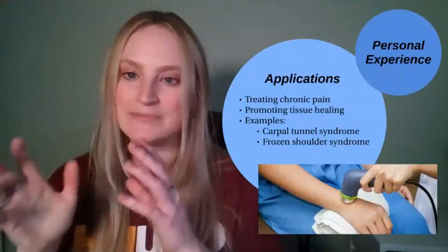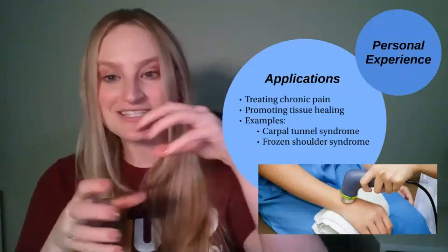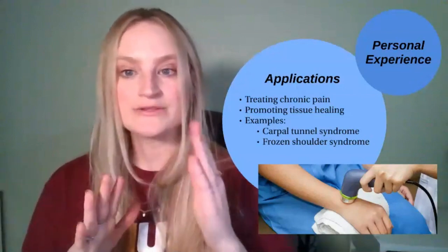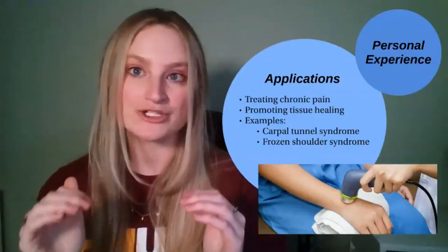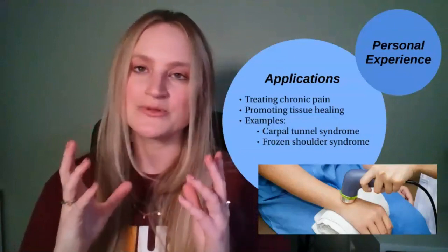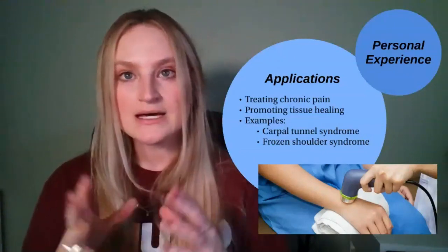Therapeutic ultrasound is the application of frequency sound waves to tissues in order to promote healing and reduce pain and swelling. Typically, 1 to 3 megahertz results in the deep heating required, and the depth of penetration is inversely proportional to the frequency utilized. There are many therapeutic benefits to utilizing ultrasound in this way.